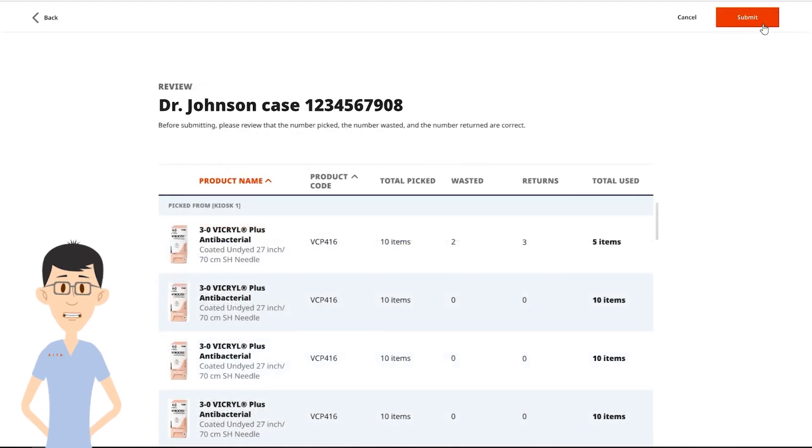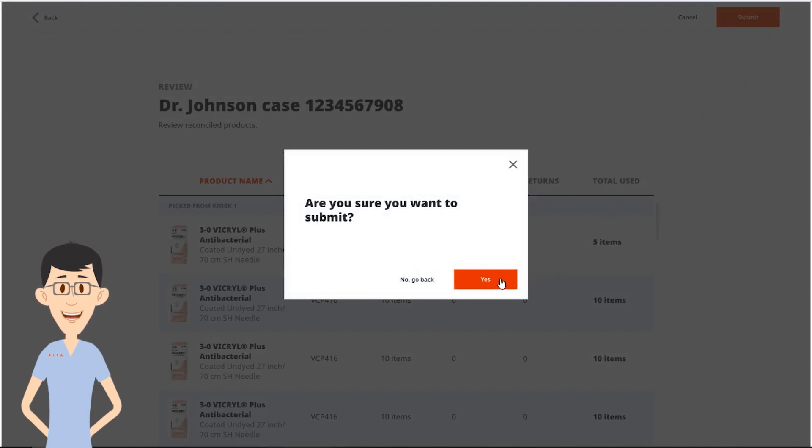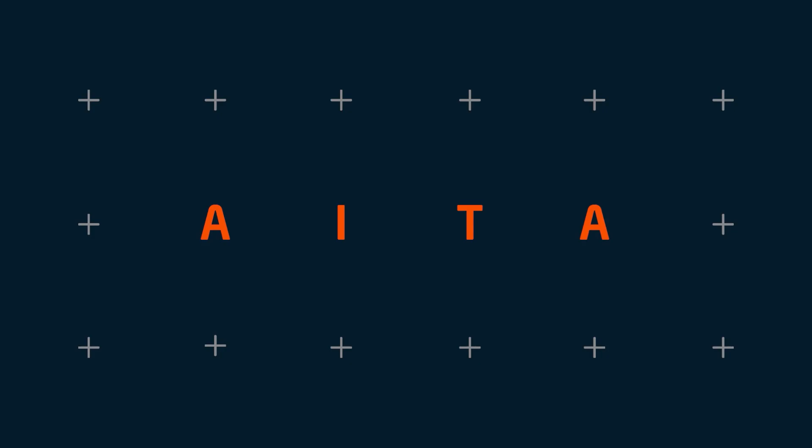When you're ready to submit, click the submit button and confirm yes. Place the remaining sutures in the restocking bins so that they can be restocked at a later time.